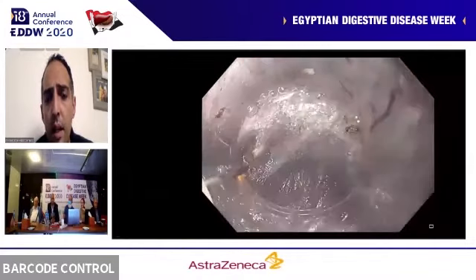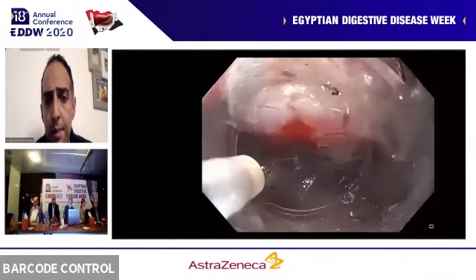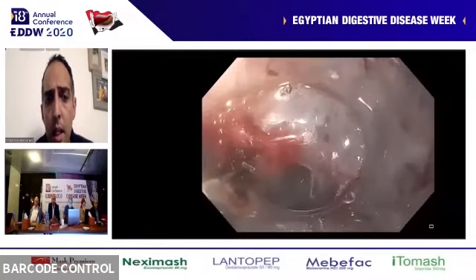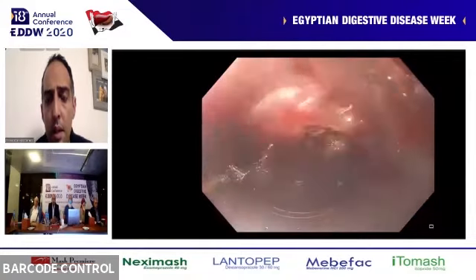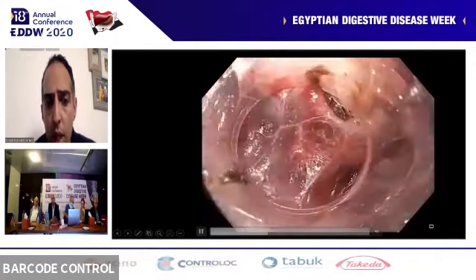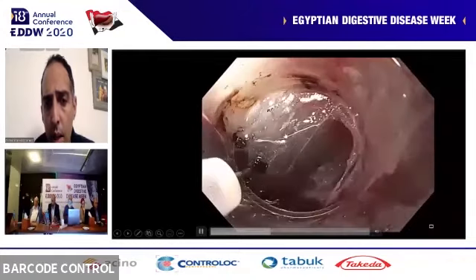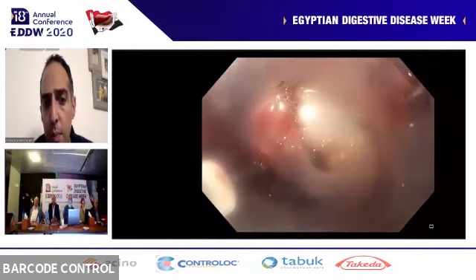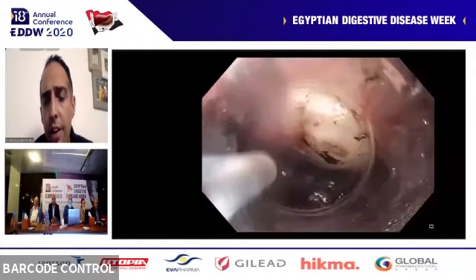Vessels are a very big problem in this area in the cardia. This is a minor bleeding, and we can coagulate it. It bled more, and it stops. I usually use this triangular knife, the TT knife. I have used many knives, but I believe this knife is very nice. You can use spray coagulation very well, and it's very rare that I will need a coagrasper.